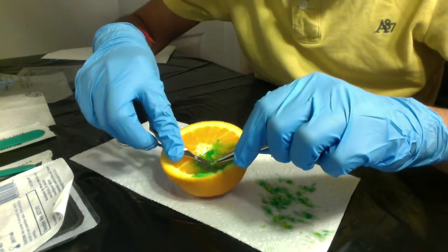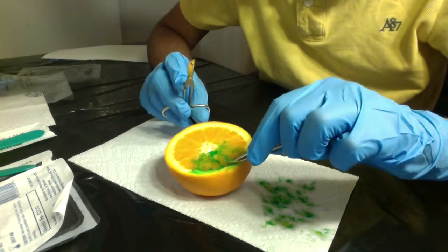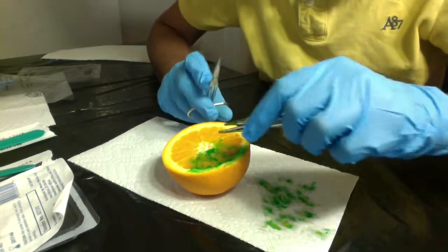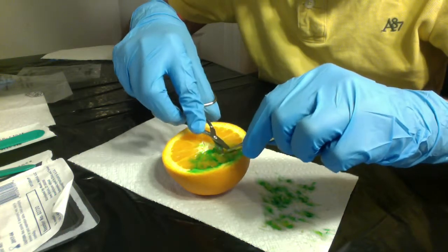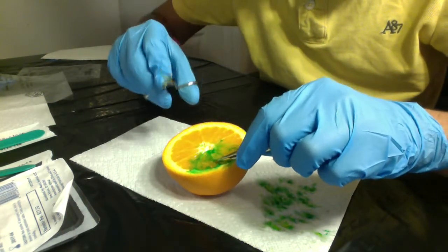pick up and debride the necrotic tissues. I'm starting to see some orange tissue underneath the dye, which suggests I should not go any deeper.